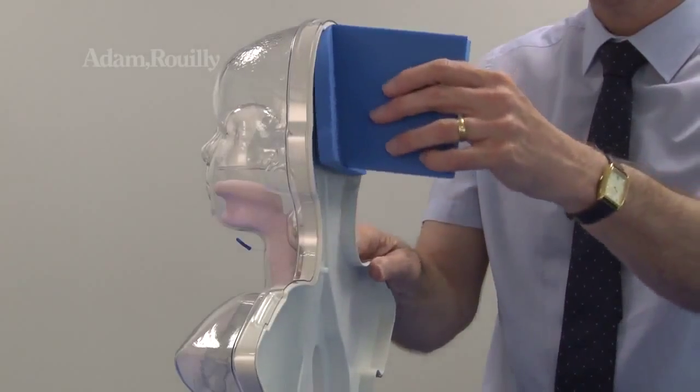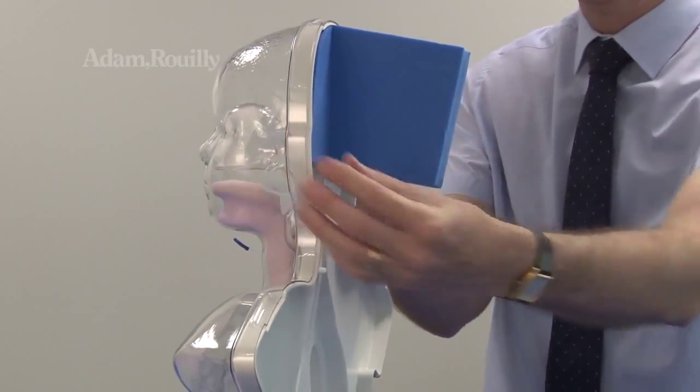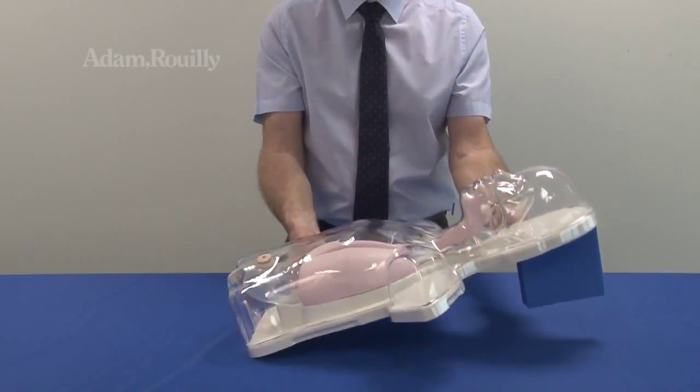To use the model in the supine position, insert the foam head support into the back of the model as shown.